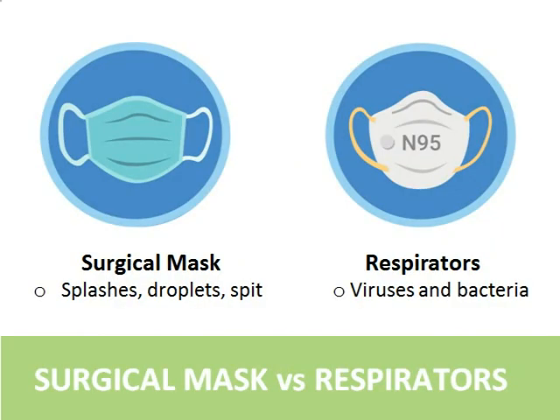Respirators are not to be confused with the more standard and common surgical or regular face mask, widely used in healthcare settings. The photo shows a surgical mask on the left and a respirator on the right. Both respirators and surgical masks are personal protective equipment, PPE, devices, and both are worn over the nose and mouth. Both are used for infection control. That is where the similarities end.